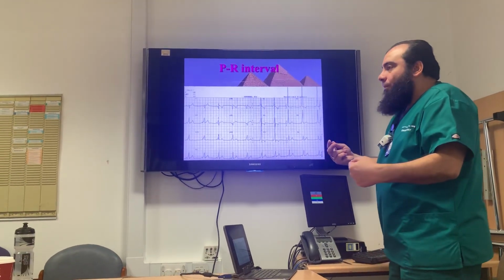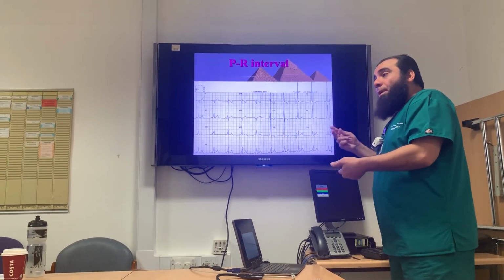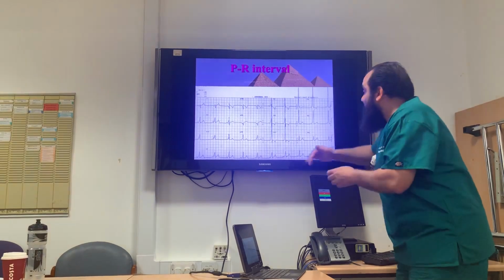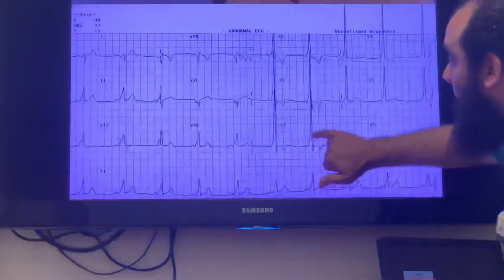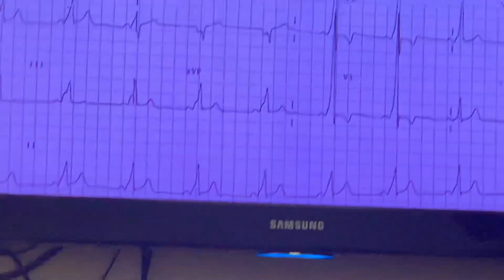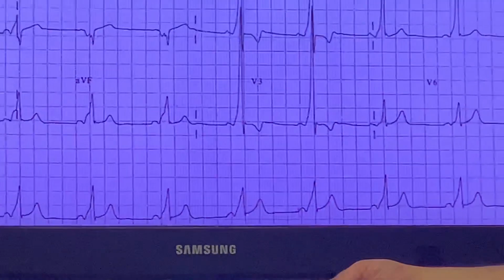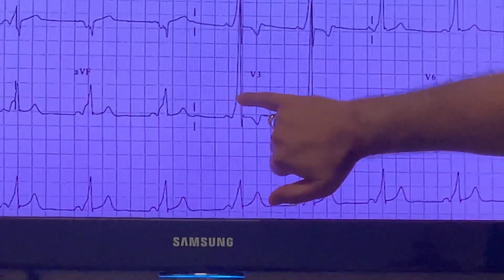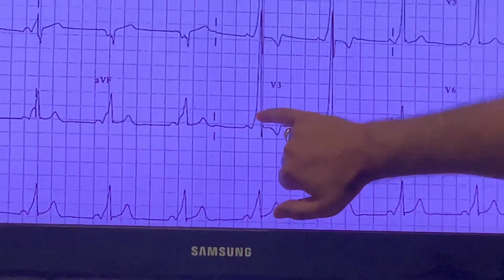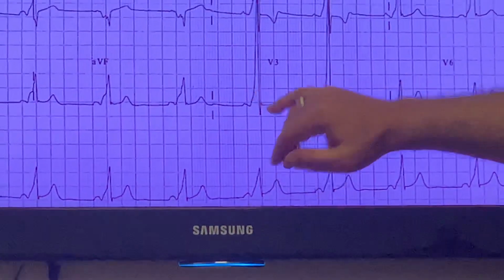If it gets through, it's going to start the impulse in the ventricle. That's why the upstroke came. What about the other one? That one is the normal one. When the time comes for the AV node to release the impulse, then it started to peak. So it will be the junction between the accessory one and the normal one.